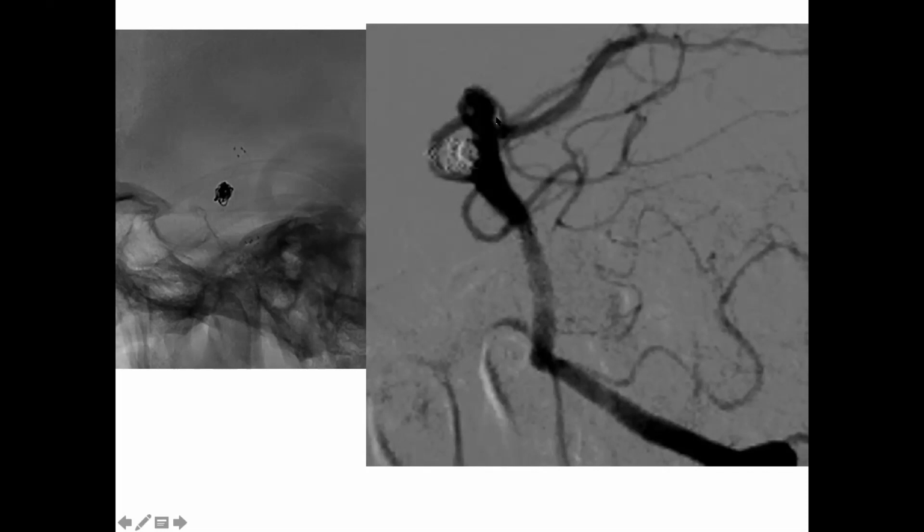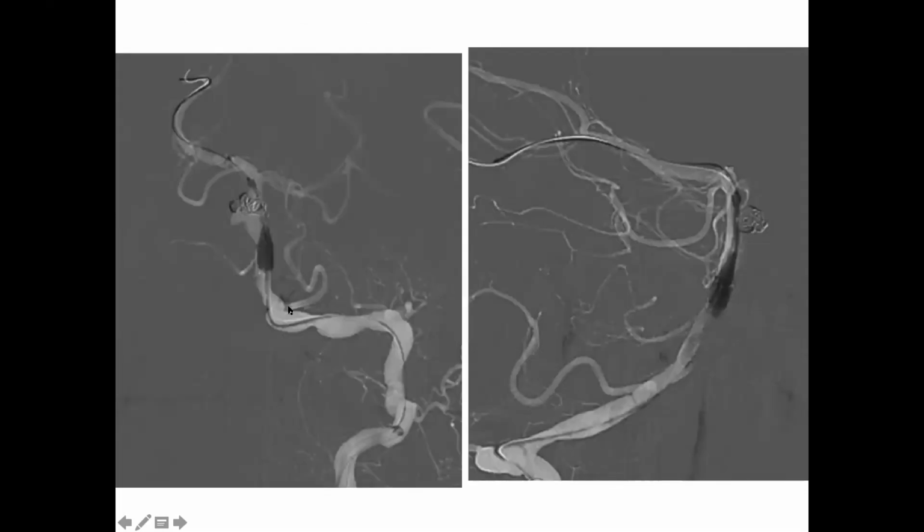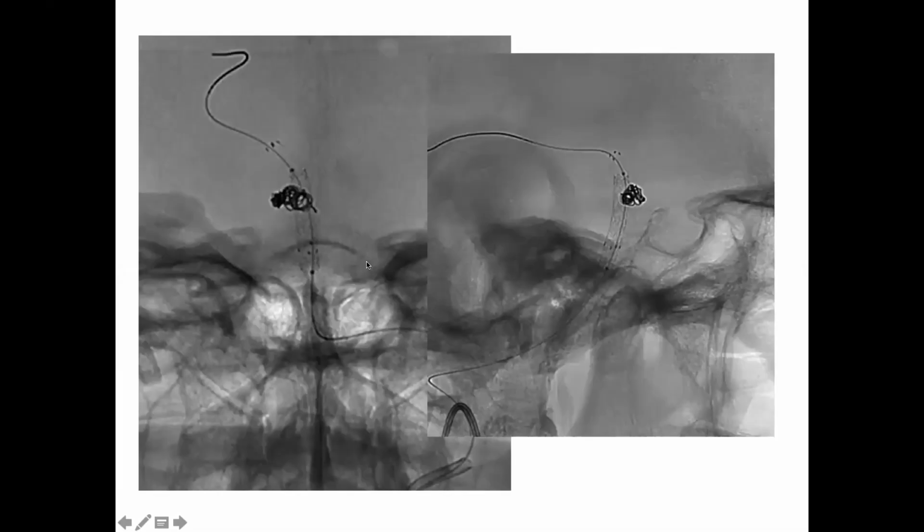This is the distal part. And 1 month later, this is before, a new sac. I decided to use a balloon cardiac stent, if you want, to deploy in this part, in lateral view. And you have this effect, real effect. You have the balloon expandable stent here, auto-expandable here, lateral view.